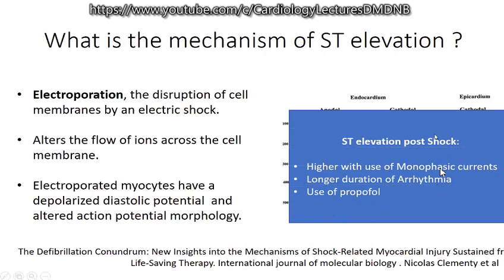This ST elevation post-shock is higher with the use of monophasic currents than for biphasic. And if the duration of arrhythmia is longer, then the patient is likely to have a post-shock ST elevation. And if propofol is used as a sedative for DC shock, because of its properties on the inward calcium channels as well as the inward sodium channels, all these factors can result in a post-shock ST elevation. Of course, this phenomenon is quite transient. It usually resolves within a few minutes.